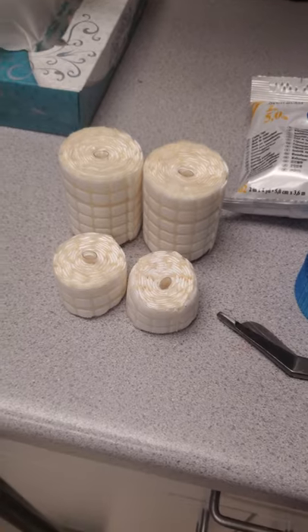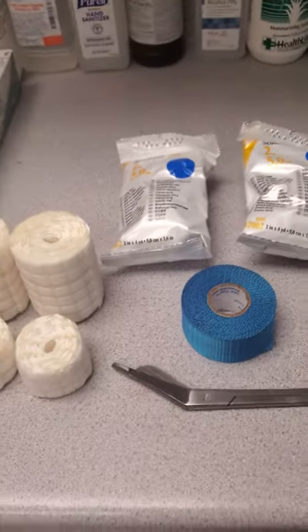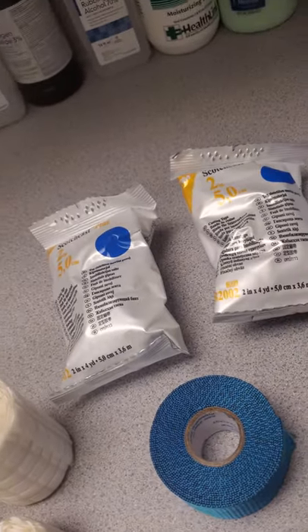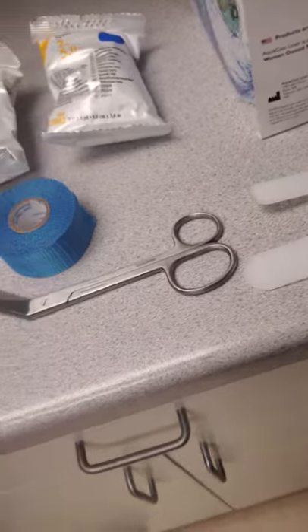We'll be using some Gore-Tex liner — the brand is AquaCast, though I'm not loyal to that product — as well as fiberglass, safety tape, which we will talk about, versus the zip sticks. And we'll go ahead and get started.